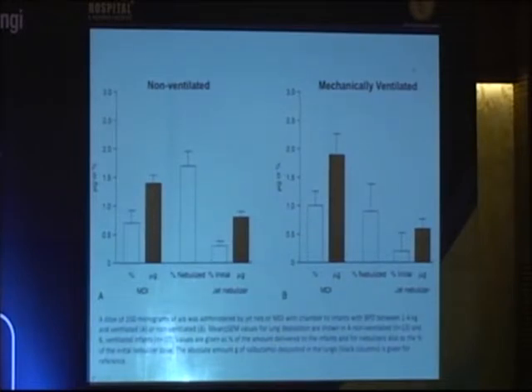So in mechanically ventilated patients, you can observe here that the PMDI with spacer provided more drug than did the jet nebulizer. So this is really some good, compelling evidence in determining, well, hey, should we use a PMDI with spacer or a nebulizer?